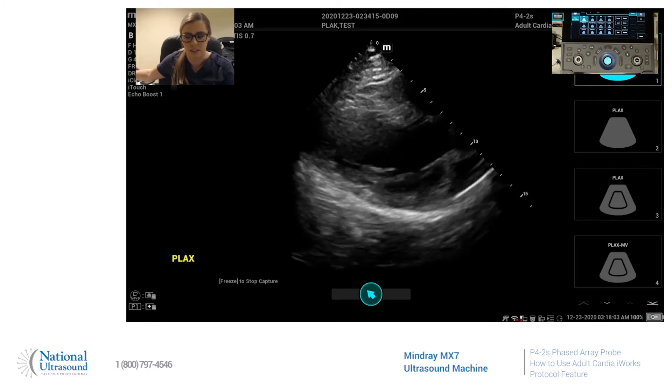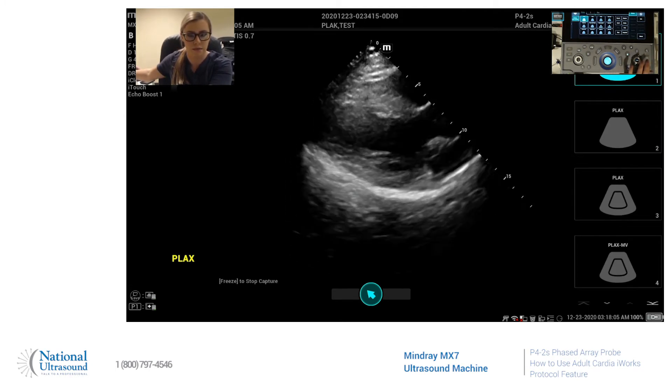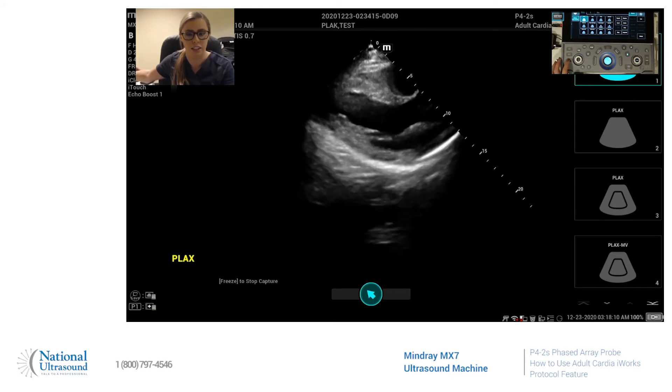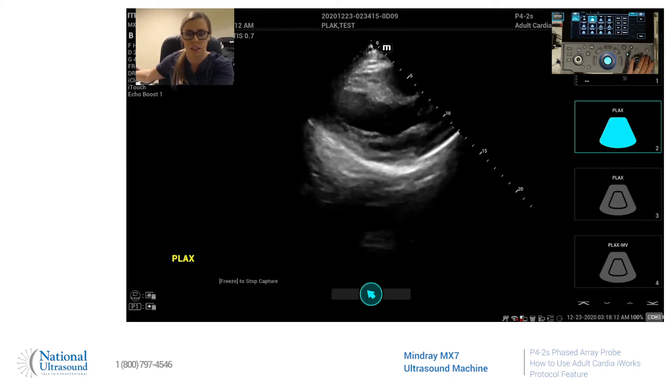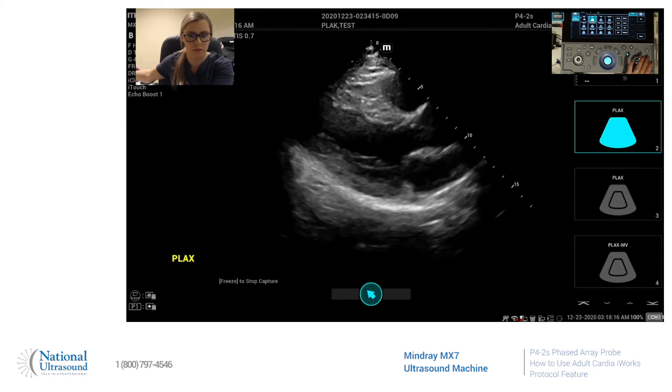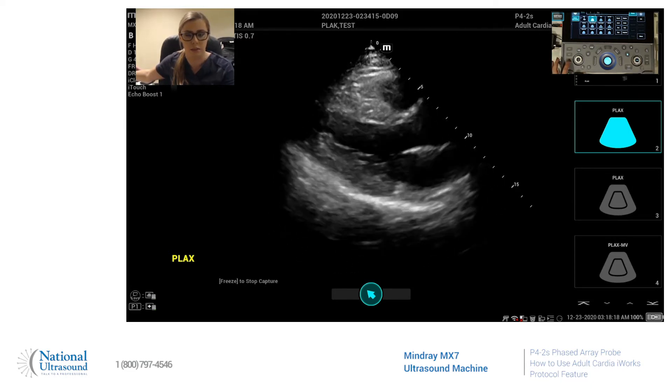First it wants you to take a survey scan. We'll do that and acquire your image, and then you will go back down to your regular long axis image and acquire that when you're ready.